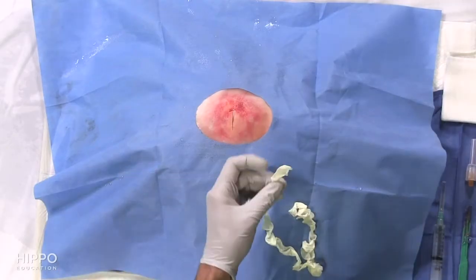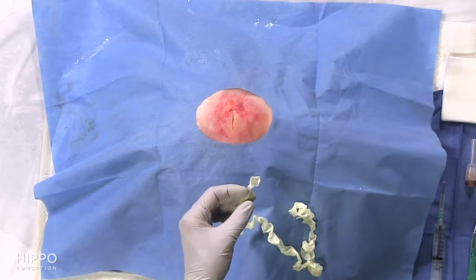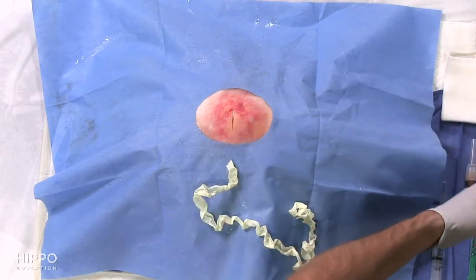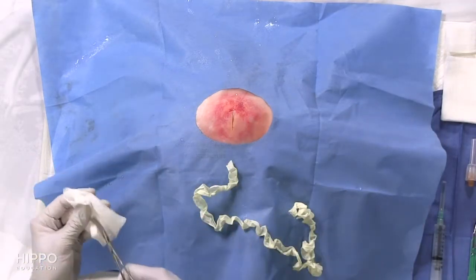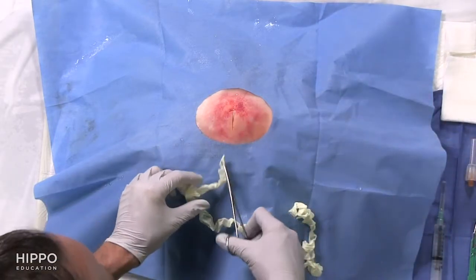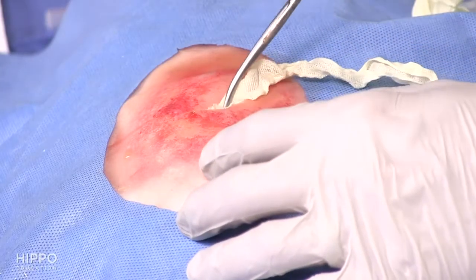This is 1/2 inch packing. You can have 1/4 inch. There's different types. Some of them are impregnated, others are plain. Doesn't really matter which ones you use. What I'm going to be using to pack it is my blunt curved forceps, cleaning off the pus, obviously. And you just basically grab the end of that packing, and you're going to introduce it into the wound.